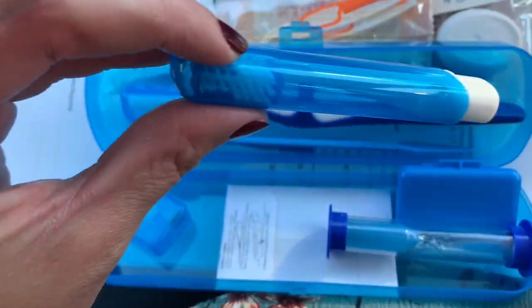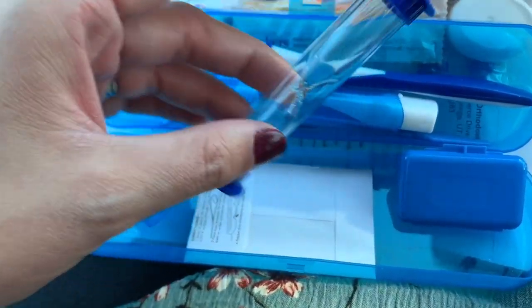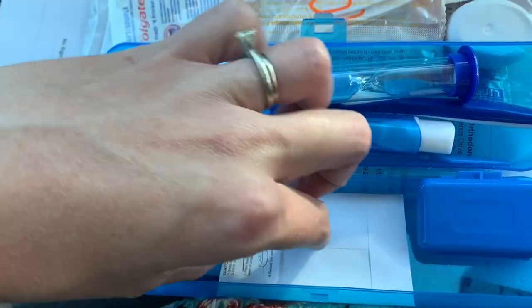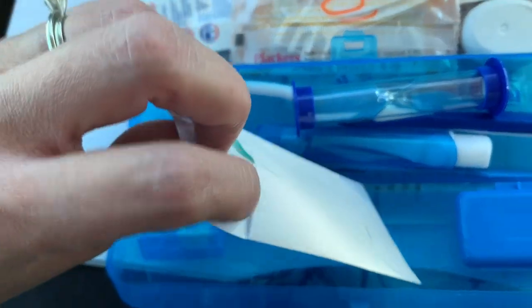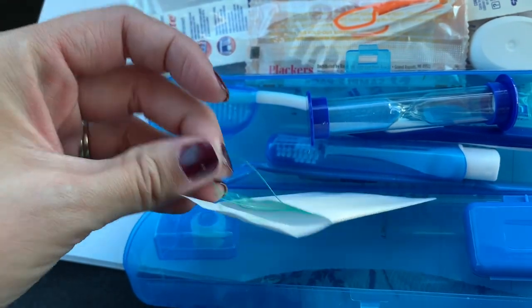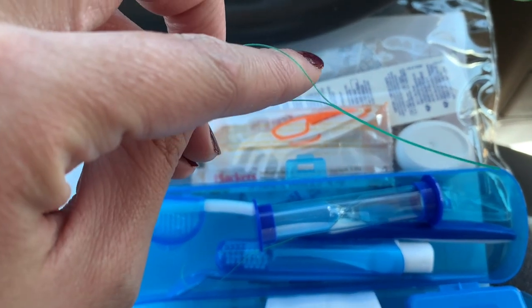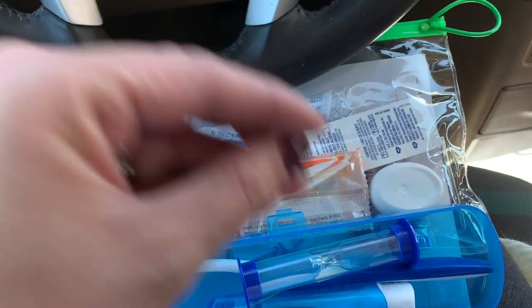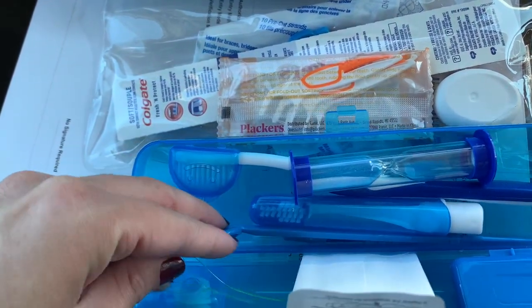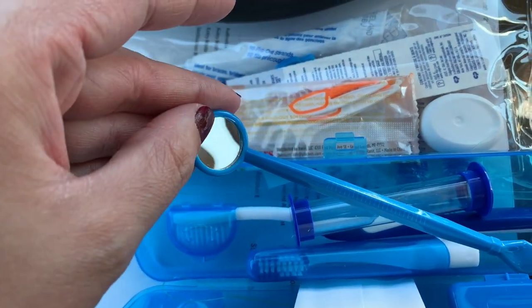So this is a little care kit for you. It has a portable toothbrush for when you're at places or need to take it places. There's a timer to make sure you're brushing, a regular toothbrush, some floss, and this is a floss threader — I'm going to show you how to do it. You put the floss through there and then put it up under the brackets and floss it. It takes a lot of time.